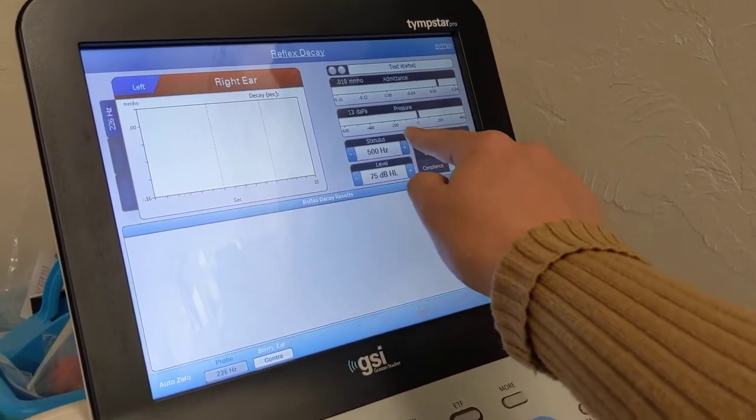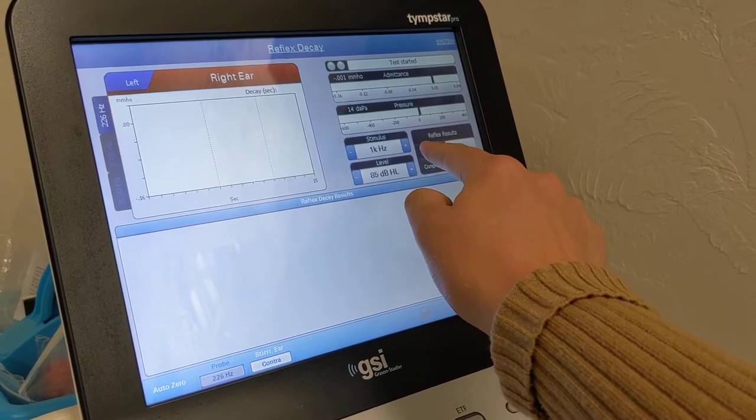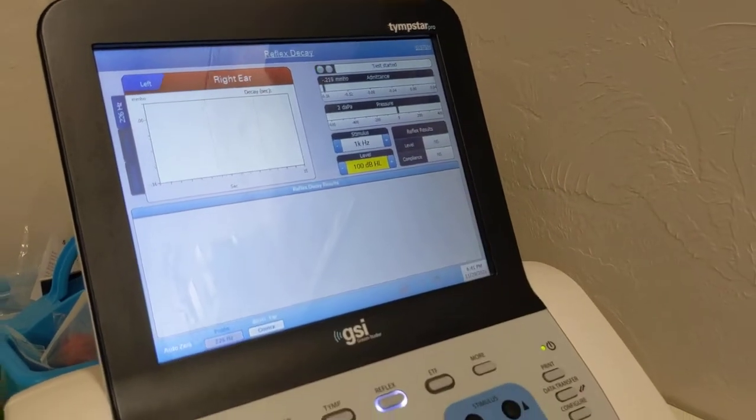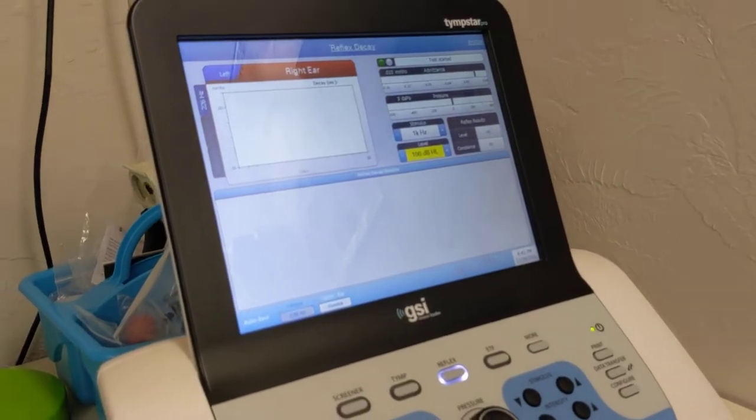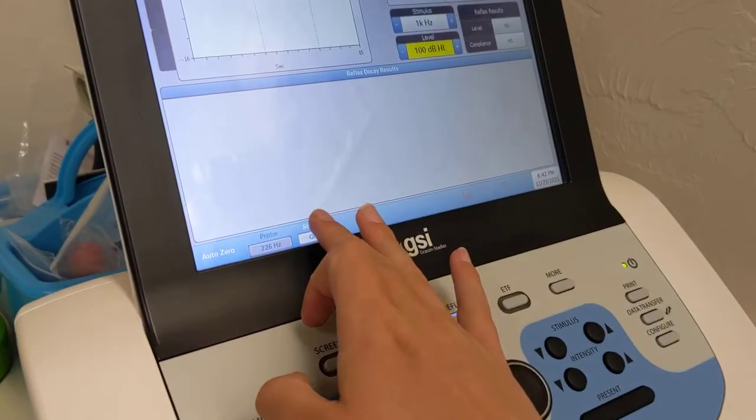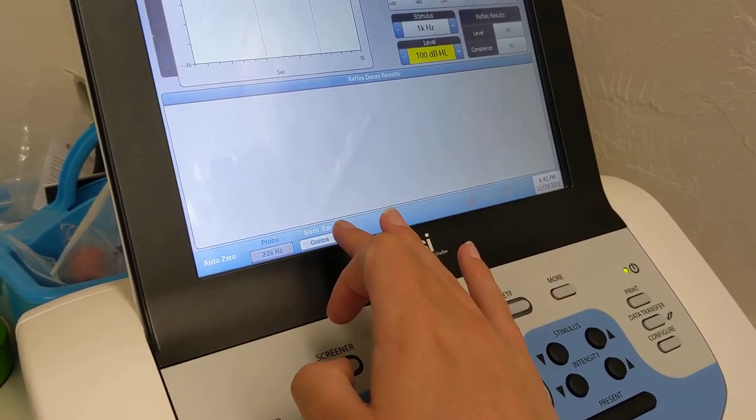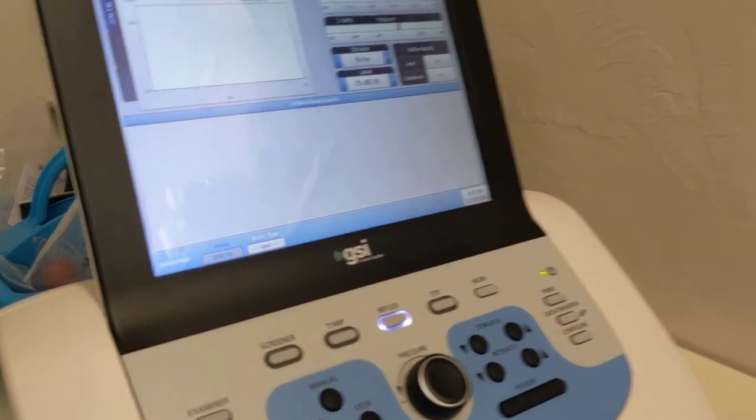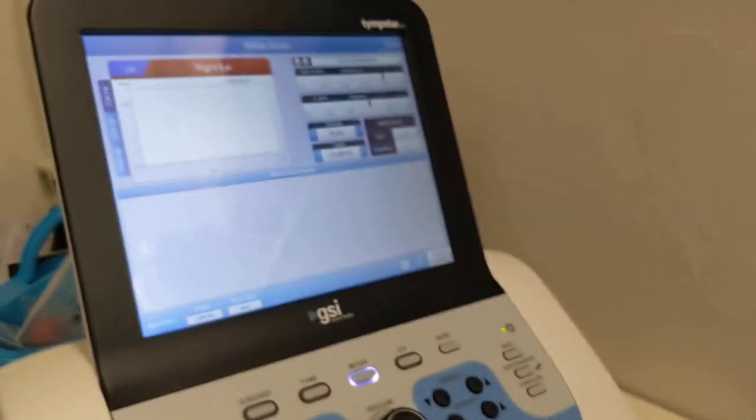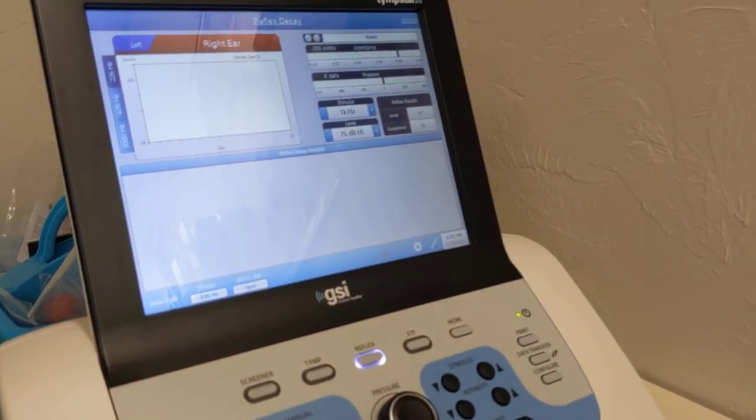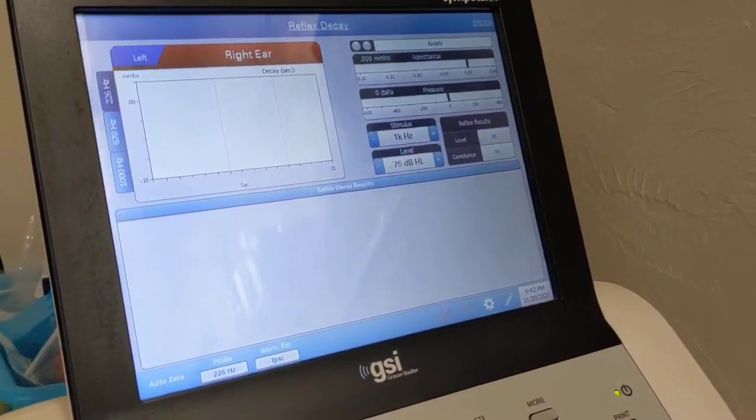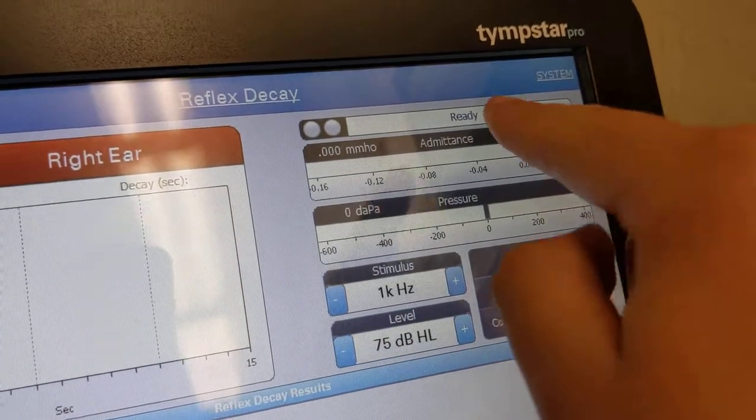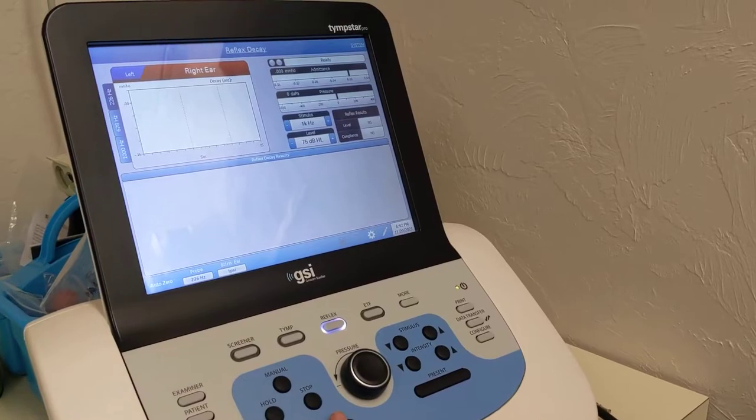Okay, so let's go up to 1000. So I was at 90. So that means I need to be at 100. And we're going to set this to ipsy. And I'm going to put this probe back in my right ear. And we can see that it's a good seal because it's blinking green and says ready. So let's press start and present.